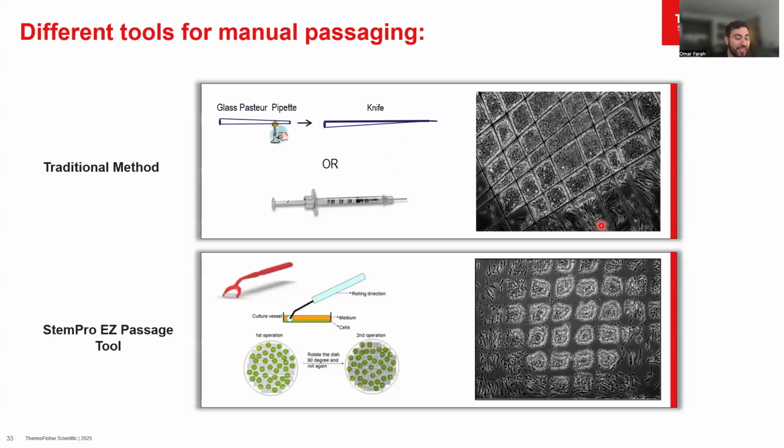There is somewhat of a learning curve, which is why I mentioned if you wanted to, you can just take a plastic plate and practice this technique. Because if you don't run the needle bevel down, for example, and run it at a particular speed, your hand will shake. So you're going to make squiggly lines instead of straight lines, which makes it harder to pick up those little squares, right?